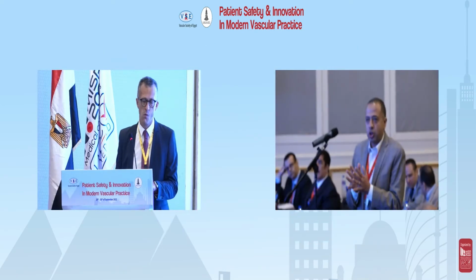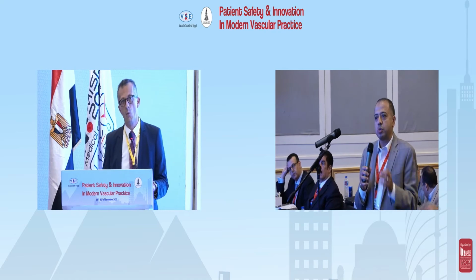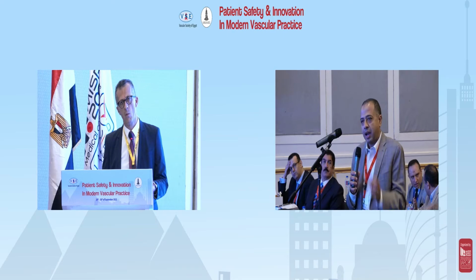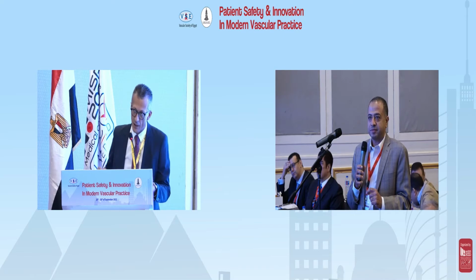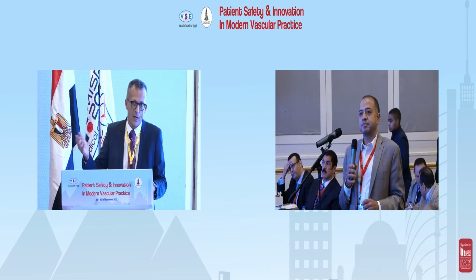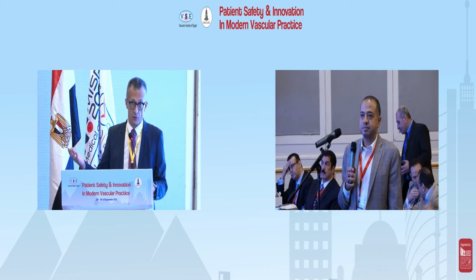Whenever I manage to cross a lesion through a subintimal route and I feel I need some debulking of the lesion, am I allowed to do it with the Rotarex or is it contraindicated? Well, we have to stay intraluminal. Usually, when we treat acute and subacute occlusion, keeping the guide wire intraluminal is quite easy. In chronic, it's not so easy.